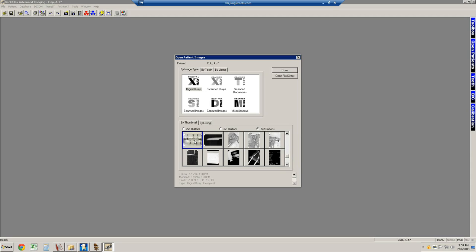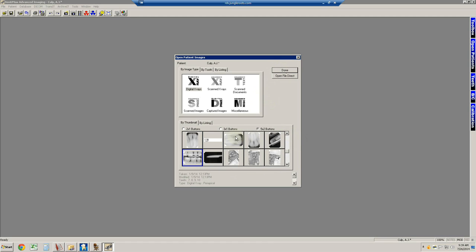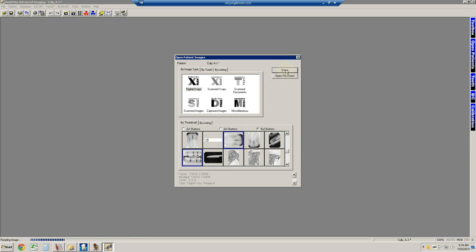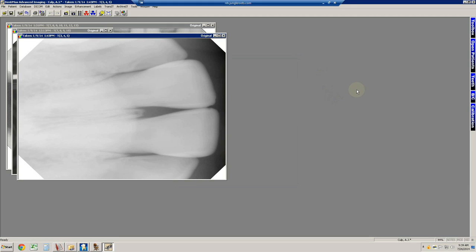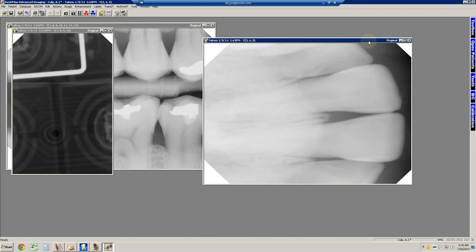You can either double-click on it, or once it's highlighted, you can hit Done, or say, for example, you want to select multiple images. You can select those images any way you want to. You can see how they stay highlighted without using the Control button. And then, when you hit Done, they're going to bring up all the different windows. Let's move this one over here. I'm going to go ahead and maximize the screen. This is an image of an X-ray of a mouse that we took just for kicks.